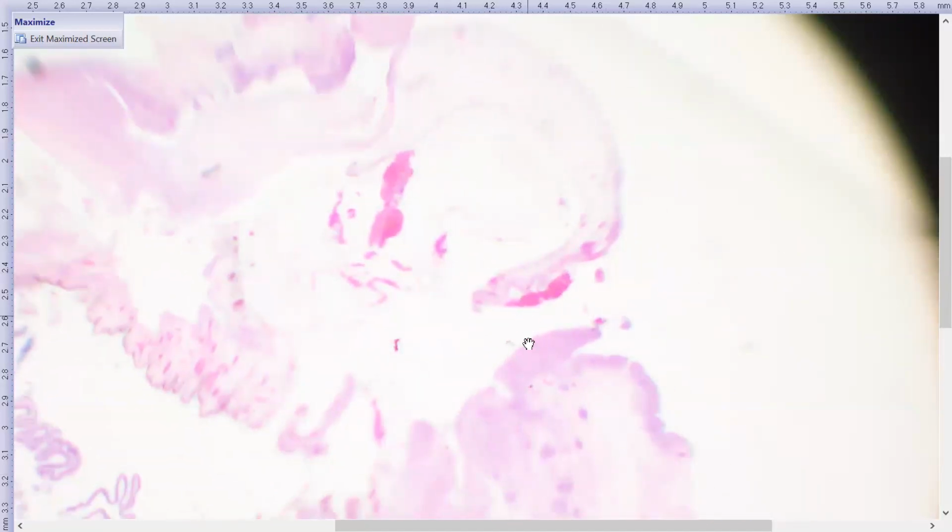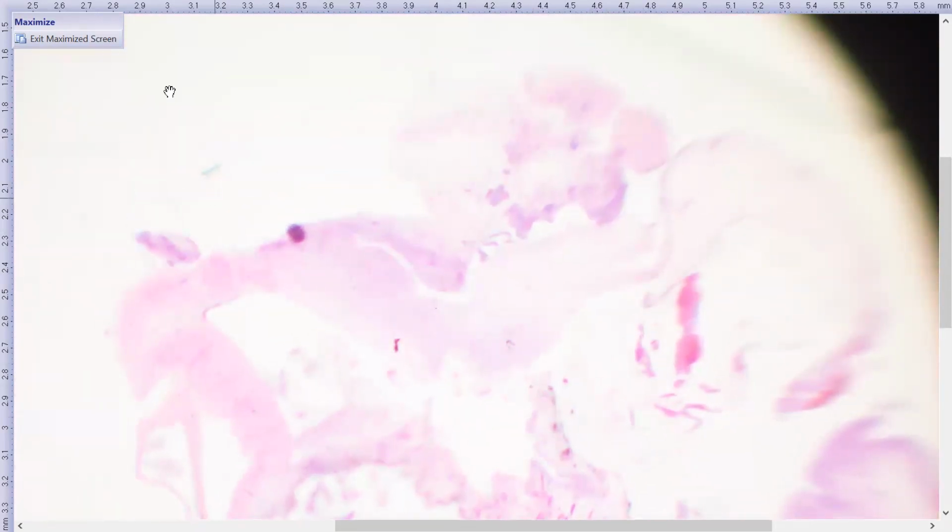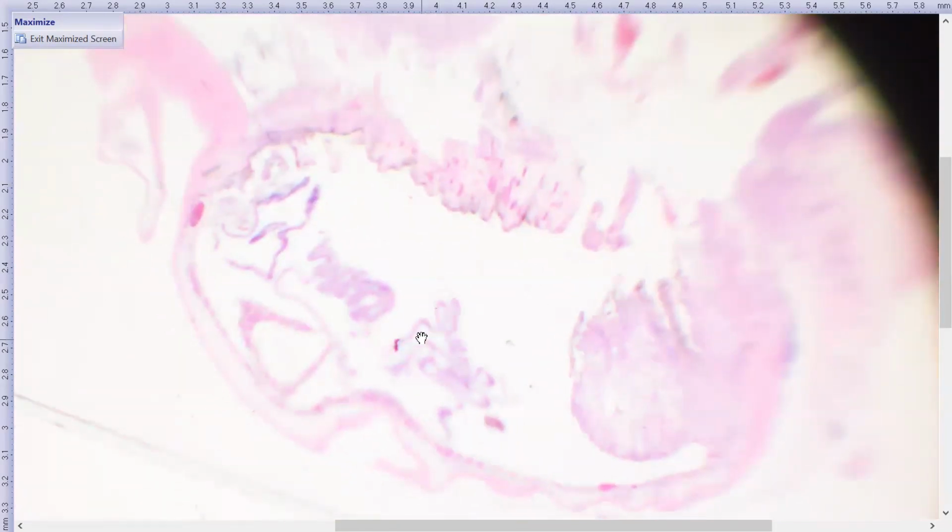There's nothing there in the front of the eye. We also have this suspicious sort of increase in cellularity, and that was represented by some degree of sort of white tan thickening of the tissue at the edges. But we've got these sort of multifocal purplish spots sort of all around. Over here too on this side. And again, that's sort of folded up, detached bits of retina on the back of the eye. So let's take a closer look.